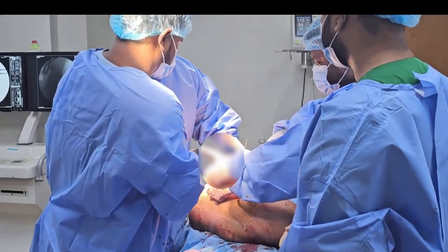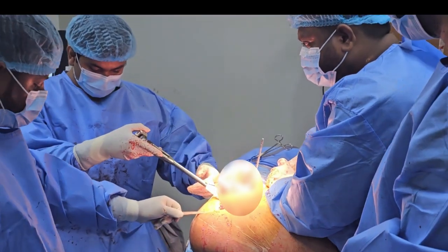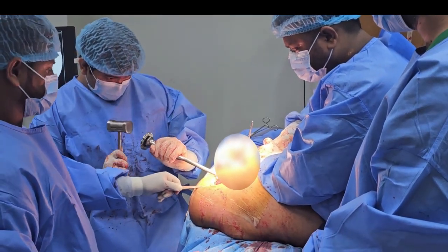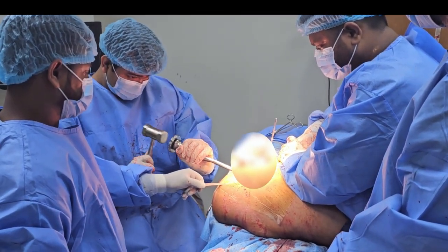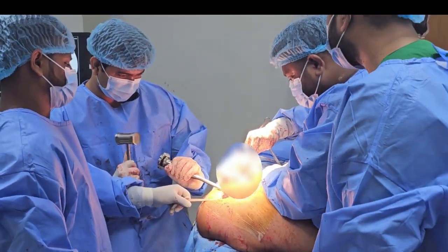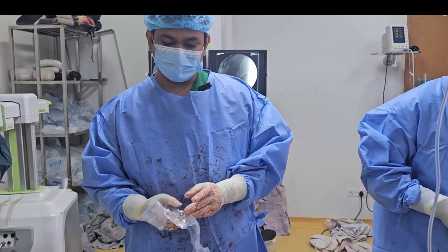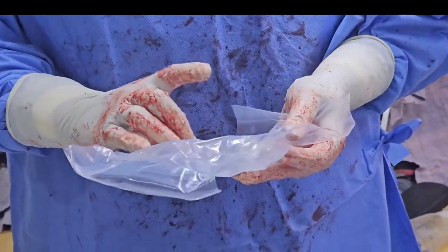This is the femoral stem made of titanium metal. We have the femoral stem, we have a modular head — so the complete assembly is titanium-based.